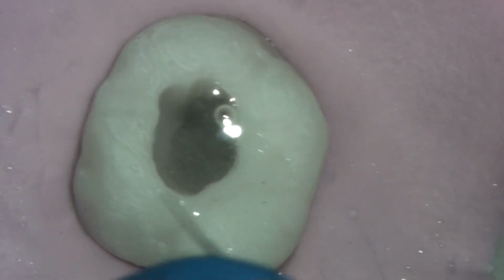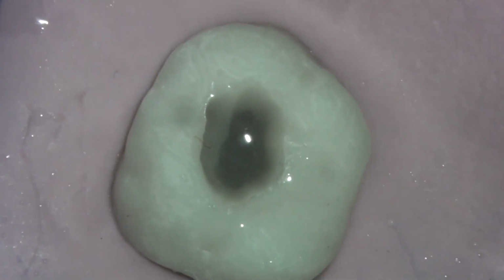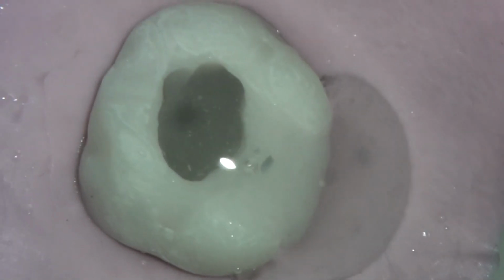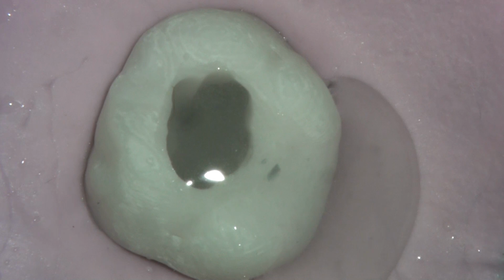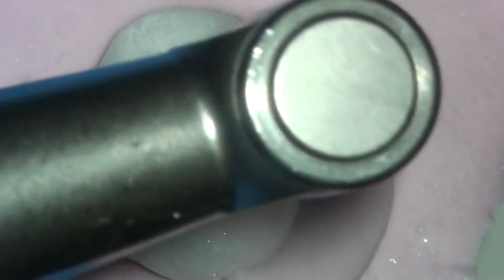We of course always re-establish patency, which we have, and we irrigate again, and I can't stress the importance of these steps enough, both biologically and technically. From that point we will go to our finishing file, or if we are doing a single file reciprocating system, our finishing file will have been carried out at that first instrument.